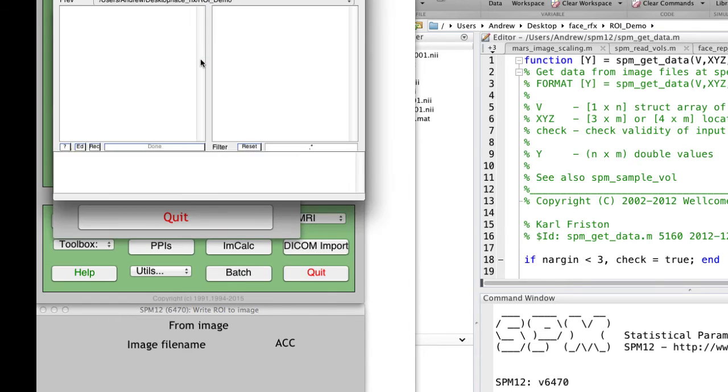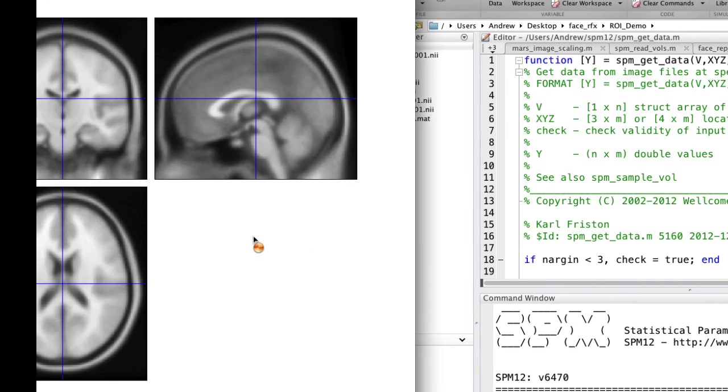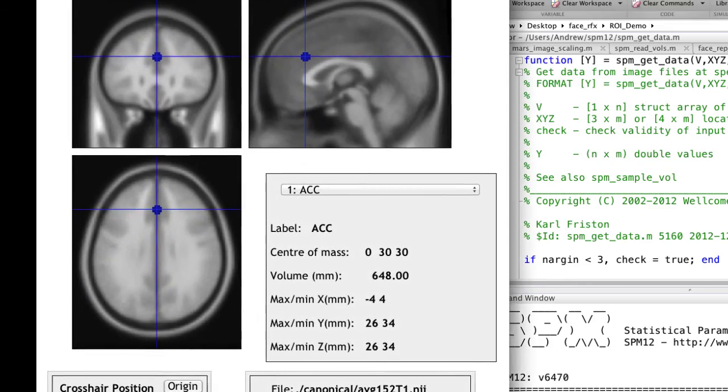Click on ROI definition, view, and the ROI.mat file, and check to make sure that the ROI is in roughly the location where you think it should be.